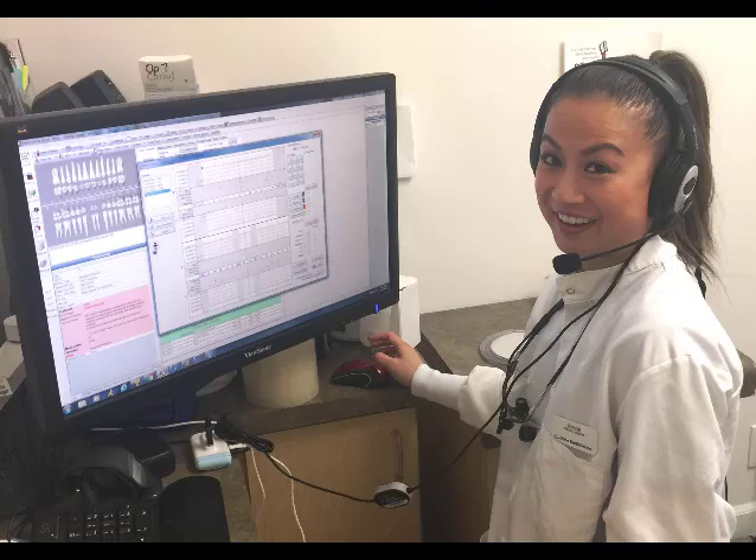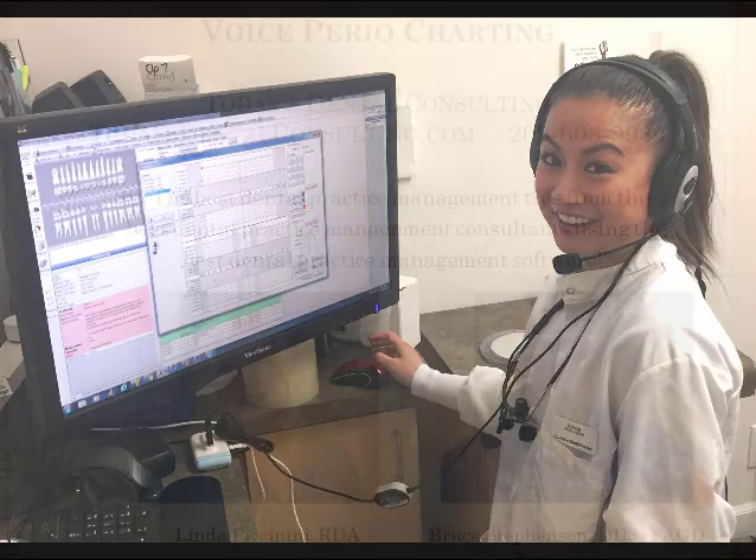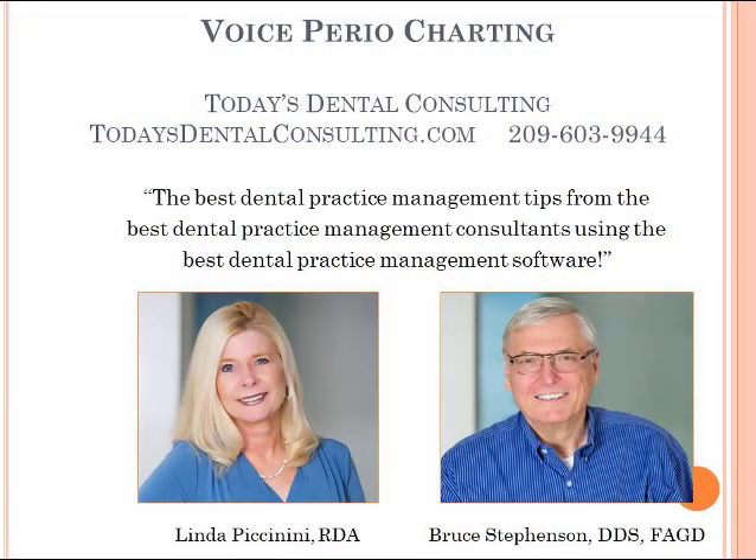Anything that you would normally chart in the perio chart, you can chart with voice — recession, attachment loss, bleeding, suppuration. Very, very nice and very complete. It may take a little training, but it's well worth your time. Let's take a little break.